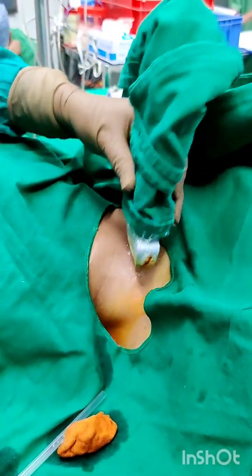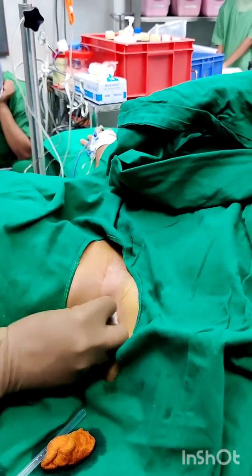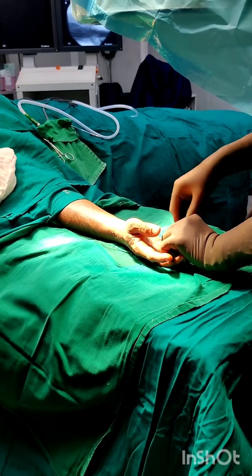Now gently withdraw the needle. Gently massage the injection site for a good spread of the drug around the plexus. Check for loss of sensation and motor power after 15 to 20 minutes.